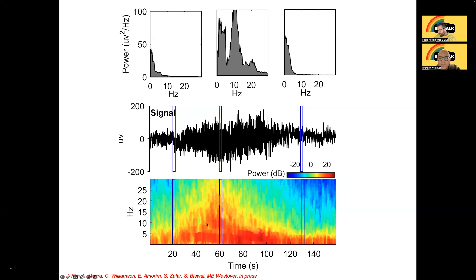Let me draw on it — okay here we go. There's one band — that's the 20 Hz one. Here's another one, and here's the other one. You can see it's dynamic: the seizure is evolving, so where that peak is actually moves down in time. But at this particular snapshot it looks like it's around 3, then around 10, and around 20 — just like we see in the spectrum above. It's beautiful!